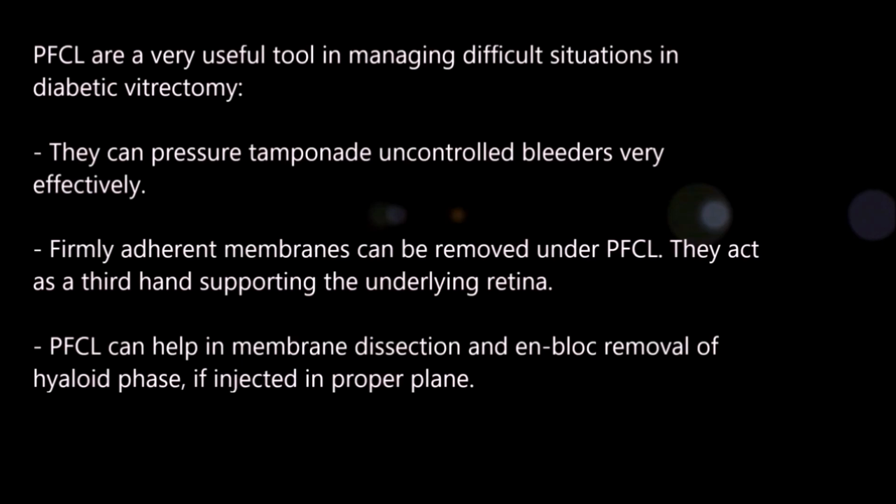To conclude, PFCL are a very useful tool in managing difficult situations in diabetic vitrectomy. They can pressure tamponade uncontrolled bleeders. Firmly adherent membranes can be removed under PFCL. PFCL can help in membrane dissection and also en bloc removal of hyaloid face if injected in the proper plane.